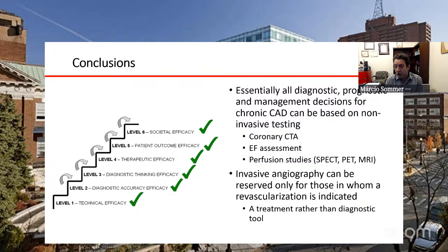And invasive angiography, to me, with all the data we have, can be reserved only for those in whom we expect to revascularize. So essentially a treatment rather than a diagnostic tool, or a very selective diagnostic tool, as most patients should be doing CT as their initial test. And I'll stop here.